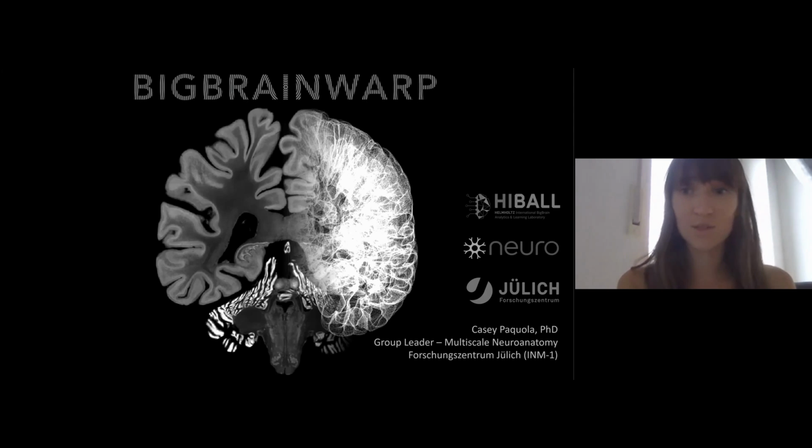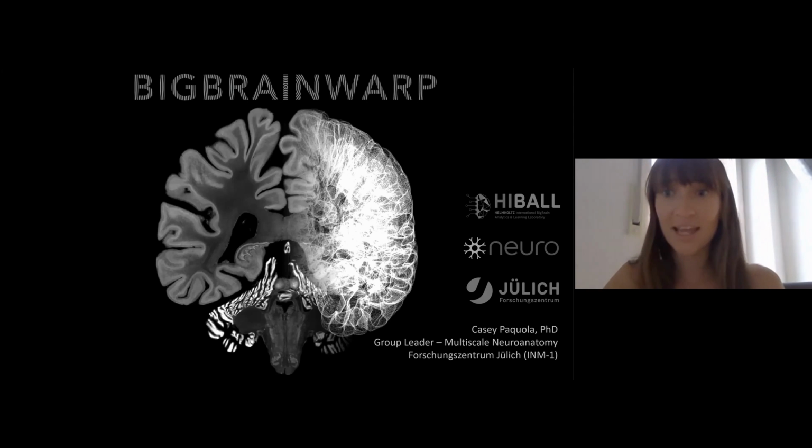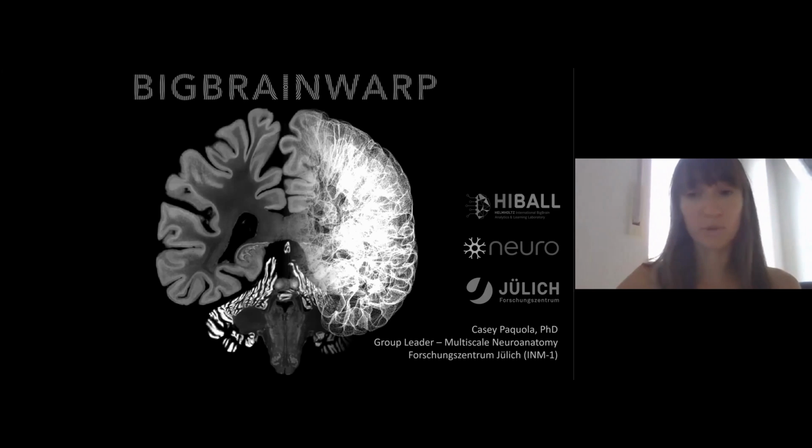In the first half of the talk, I'd like to discuss the conceptual background and the motivations for building the toolbox. And then I'll describe 2 examples of how we've used integrated BigBrain MRI analyses in the past. And then in the second half, we'll delve into the toolbox itself and finish up with a little demonstration of how you can use it. Feel free to put your hand up if you have questions or just ask in the chat.